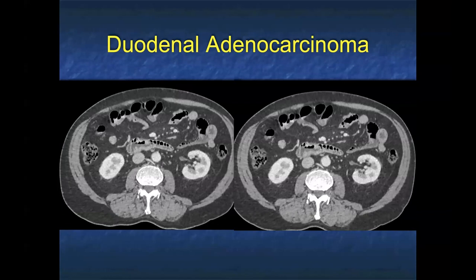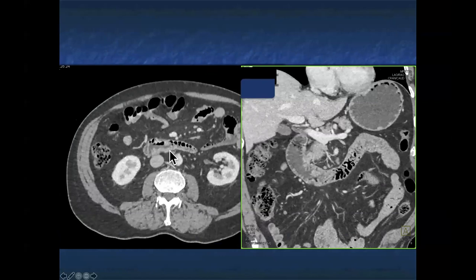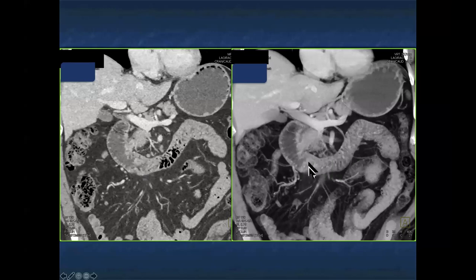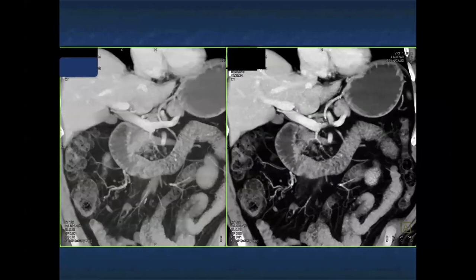Here's another case that was read as negative. Look at the third portion of the duodenum — it looks different than the fourth portion. When you go from the axials to the coronals, you see the nodularity in the third portion. Again, you can see the importance of good distention of the stomach and small bowel — water is critical. You can see the nodularity in this patient with adenocarcinoma nicely on volume rendering. This is a small tumor, maybe a couple of centimeters, no obstruction, and very easy to miss. If the duodenum was not distended, you would surely walk by this case.